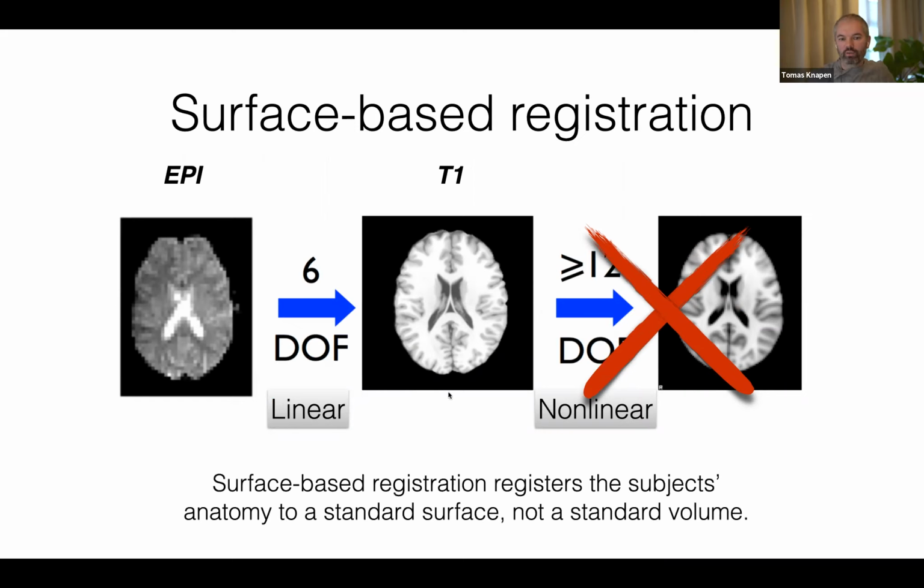So we take out the standard volume, and we're going to start using the fact that the cerebral cortex is organized as a sheet. Yeah? So those sulcal patterns aren't there for nothing. They are there because the cerebral cortex works as a sheet, as a surface, and it's so big that it needs to be crumpled up inside the skull. That's why we have the sulci and gyri.